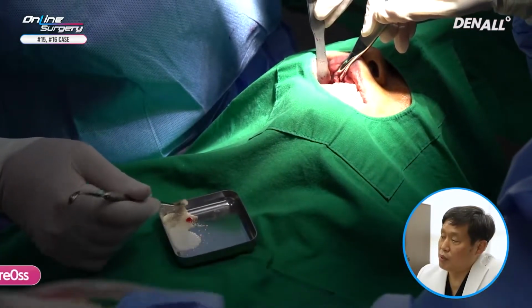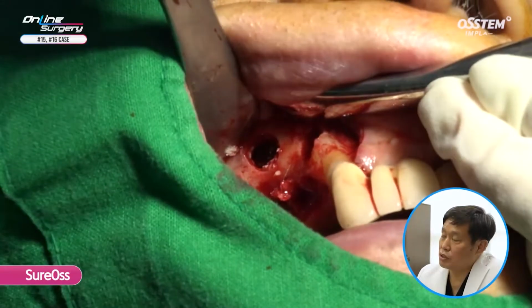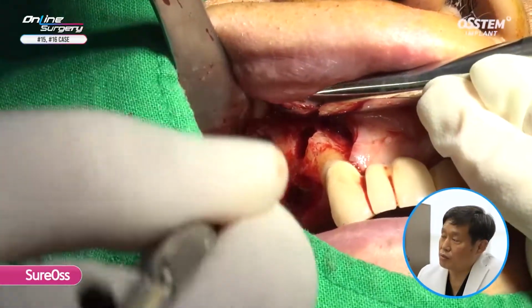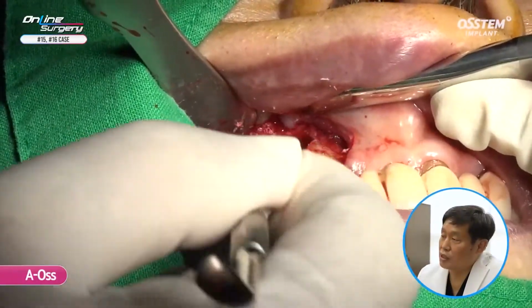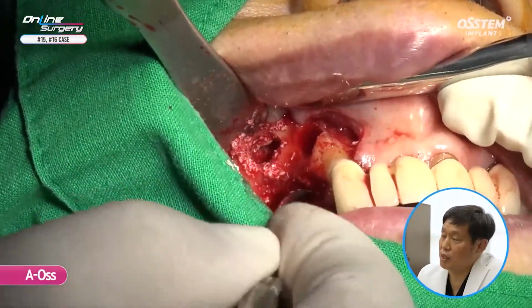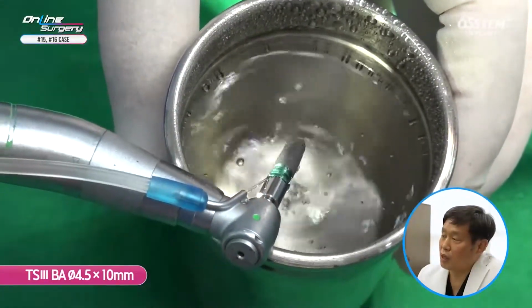Allogenic bone, Sure Os, and AOS, which is bovine bone, is used for bone graft. On the host bone side, Sure Os is used, and on top of it, AOS is used for bone graft. The diameter of the LAS drill is 7 millimeter. Bone graft is done.